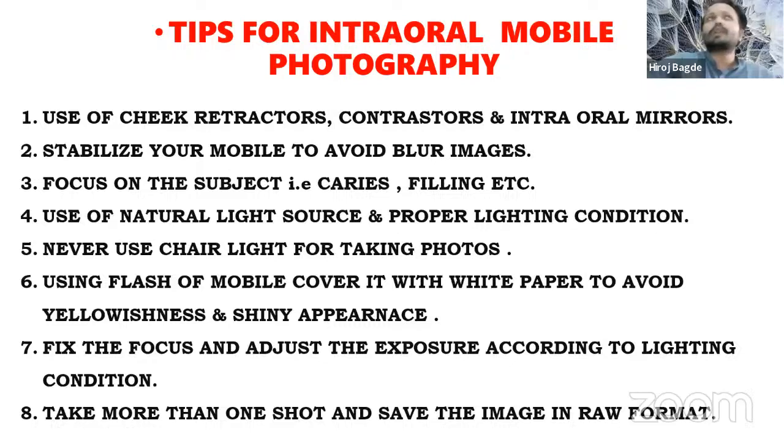Yesterday we talked about different kinds of areas. We are talking about anterior aesthetics. We are talking about different areas of the posteriors where the caries are there, filling is there. We have to restore those areas, so we have to justify what we are focusing on. If we have an anterior aesthetic case, we will definitely focus on the anteriors. We will not have all the other teeth inside.